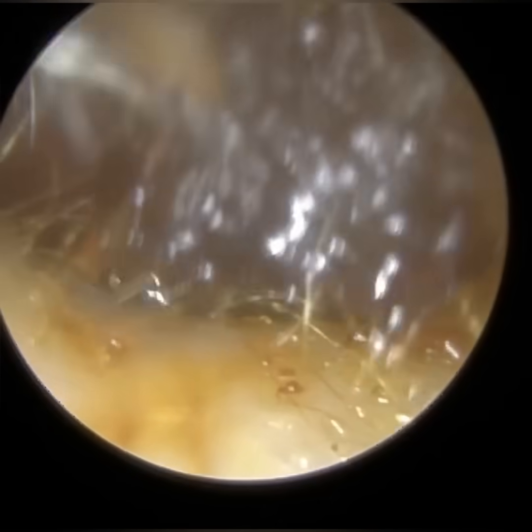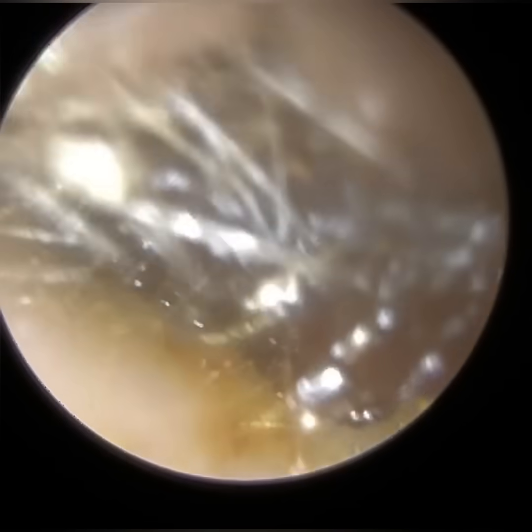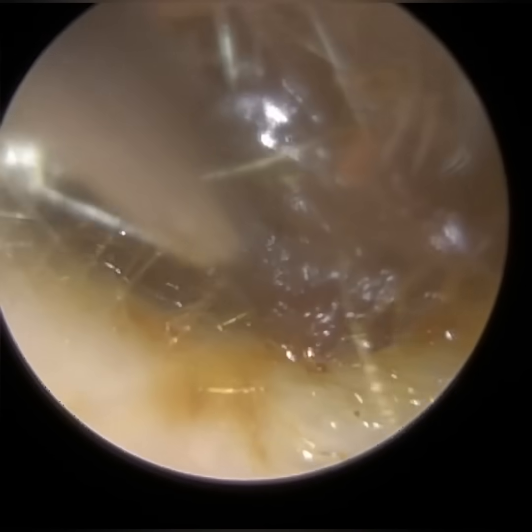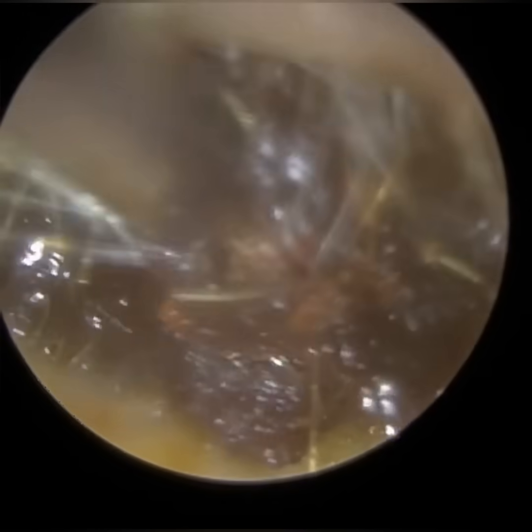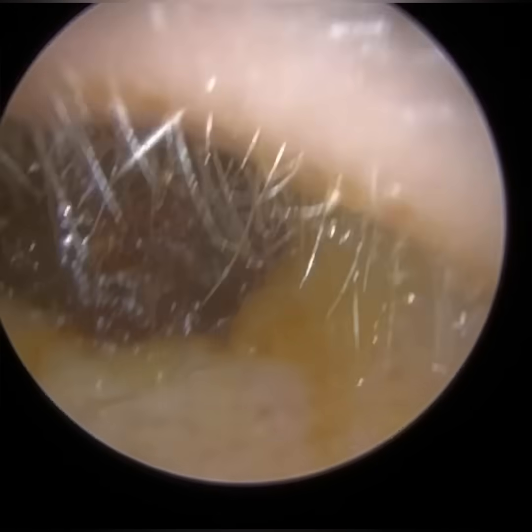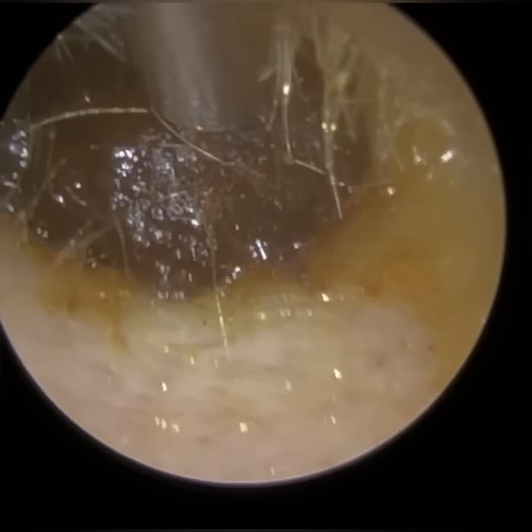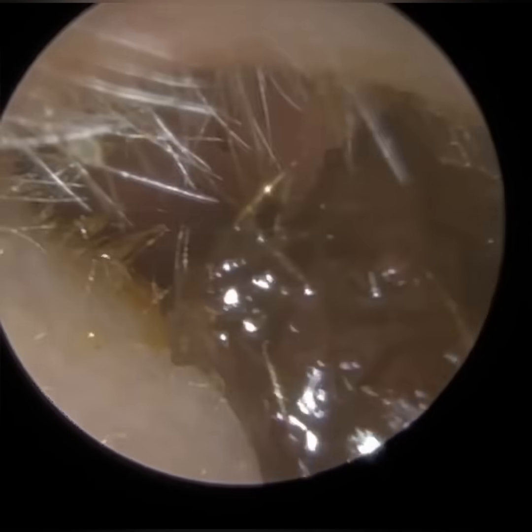As I did, it brought forward the wax plug. The reason I switched instrument was because of the clarinetting. Clarinetting is when you're suctioning dead skin in particular — the skin can violently flap at the tip of the suction probe, and that emits a very loud, high-frequency squeal. It's not only loud for the patient, it's loud for myself, so you want to try and avoid that.